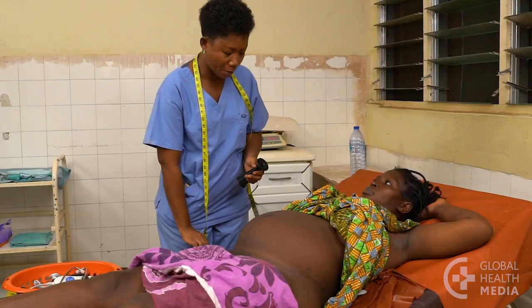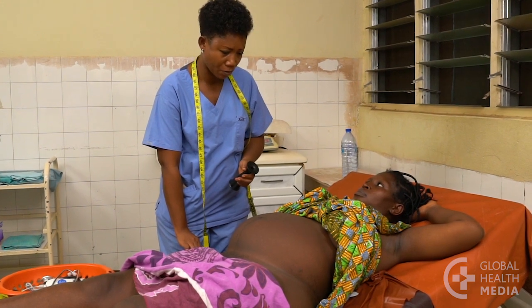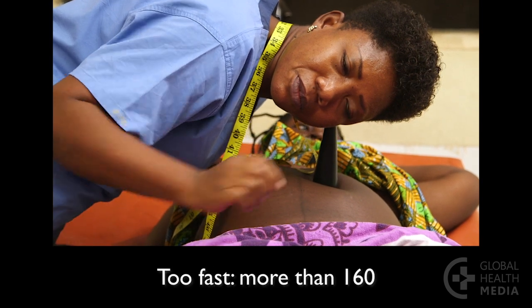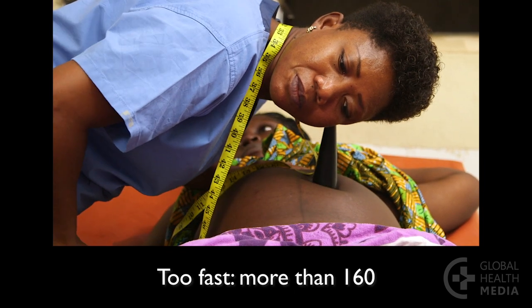Every time you listen to the baby's heart, decide whether the rate is normal or not. A baby whose heart rate is slower than 120 or faster than 160 for more than 10 minutes may be in trouble.